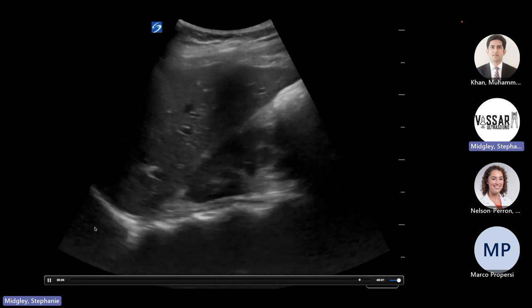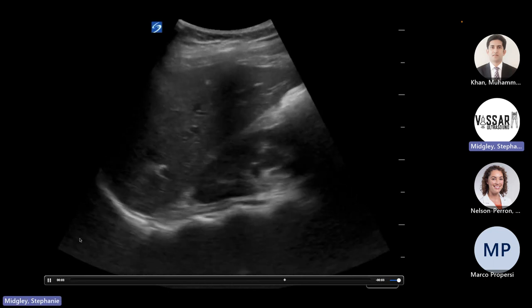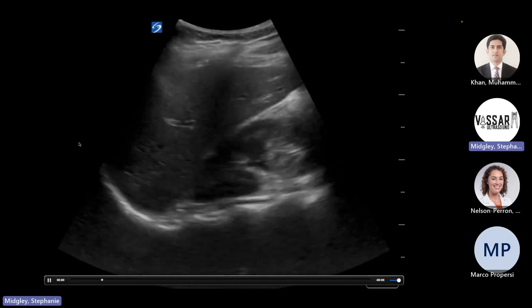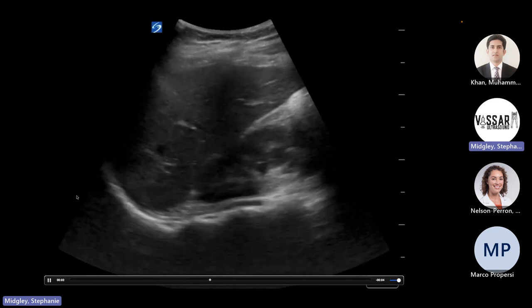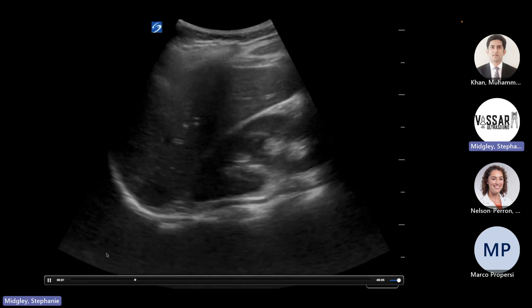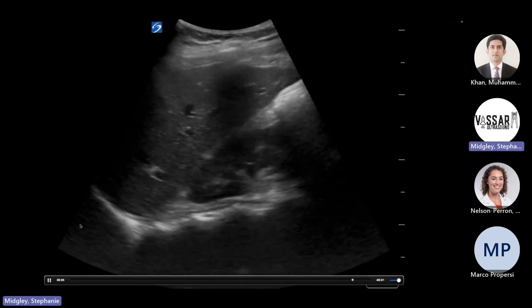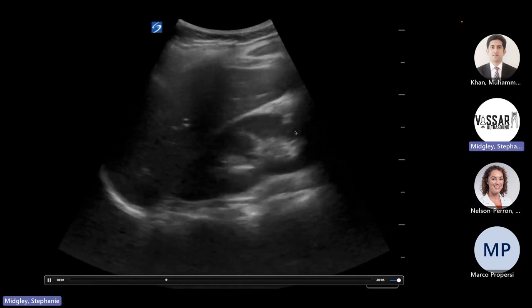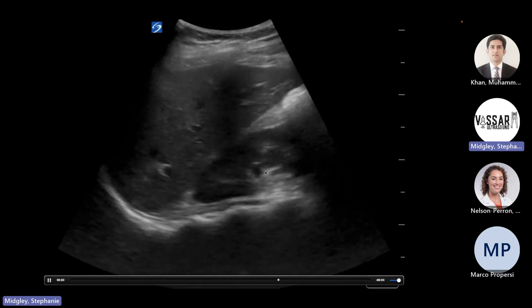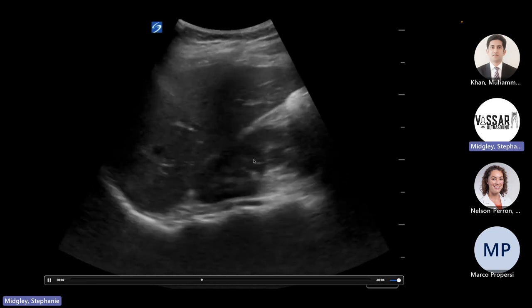Right? So there's no effusion, there's no pneumonia, there's no contusion down here, because I do not see the spine above. So now all that sound wave is not transmitting through that aerated lung. So absence of spine tells me it's normal. And then not only do I look above, I also want to look at the kidney too. So just kind of quick eyeball the kidney, make sure it's got a good outline, looking for cysts, looking for hydronephrosis.